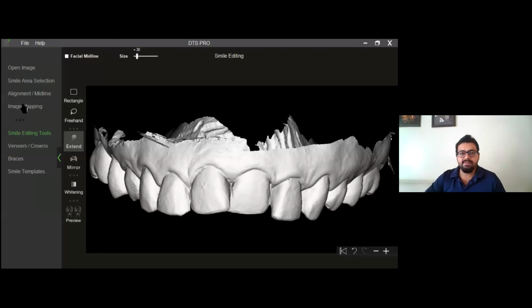So I'll see if there are any questions and we can take simulation of an orthodontic case, I think. Okay, I have an interesting question and I do come across these questions a lot of times. How do you address the medico-legal consequences of the projected simulations as compared to biologic limitation? Because the patient will ask for a pre-treatment simulation and hold you accountable of not giving the promised result.